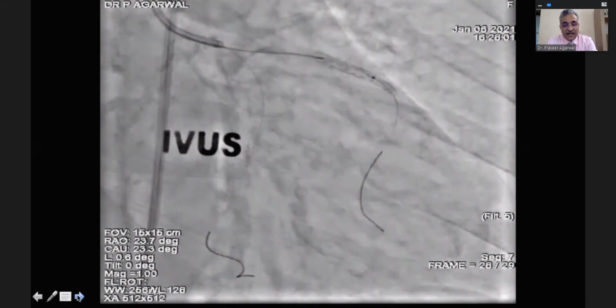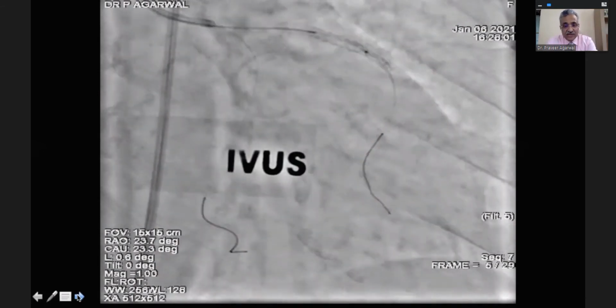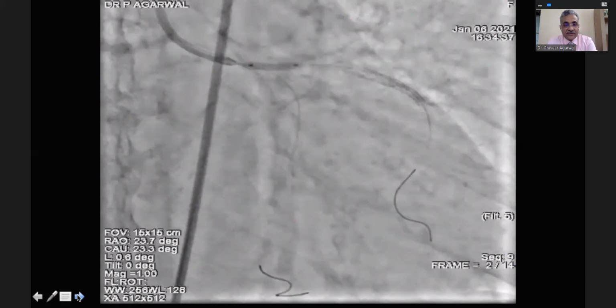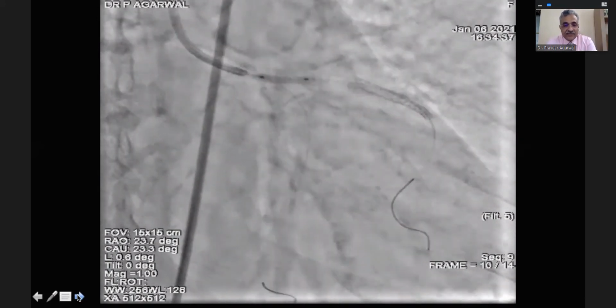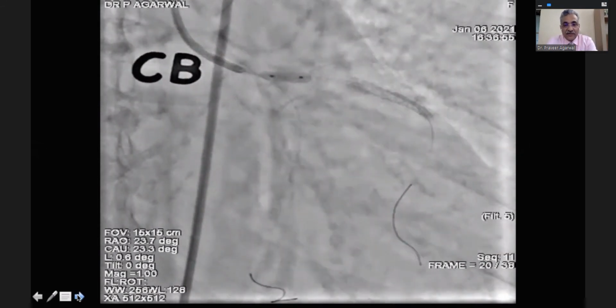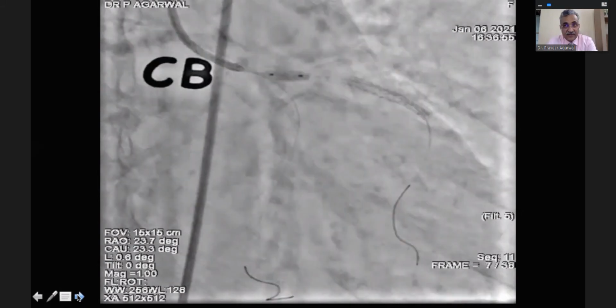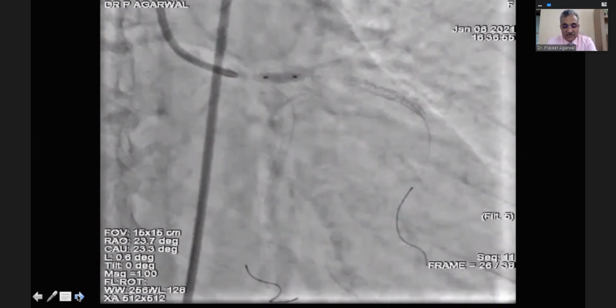So after the IVUS, and IVUS also showed it's a fibrotic lesion. It's not a very bad calcium there. So we just did a 2.5 balloon to just make room there. And then a 3.5 cutting balloon at nominal pressures to just cut the plaque as usual, because the ostial lesions behave badly if you don't cut them up. And then it's a 4.0 stent.